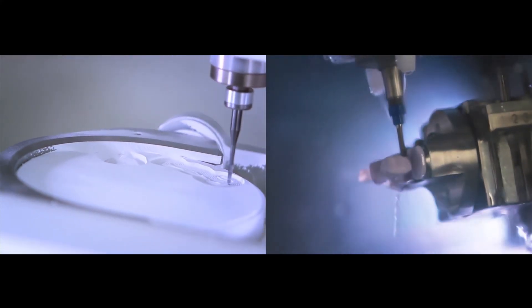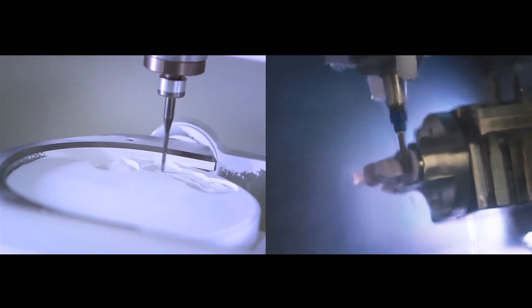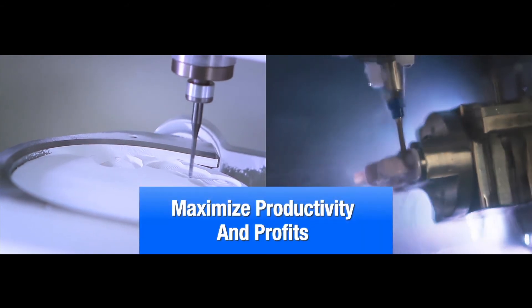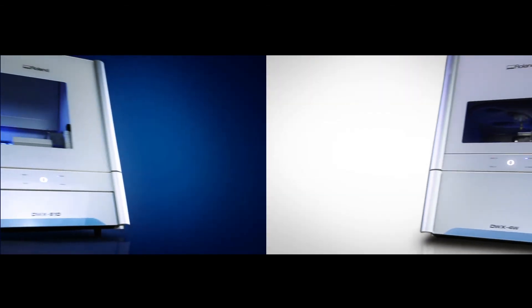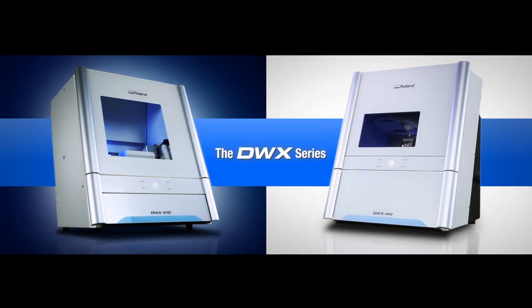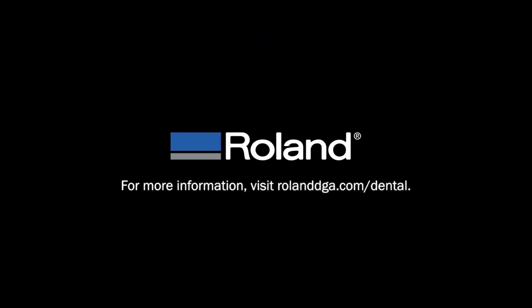For the most flexible and time-saving wet and dry milling solution, use the 51D and 4W together and maximize your productivity and profits. Dental milling has been redesigned with the smarter, easier, and more efficient than ever DWX series from Roland DG.